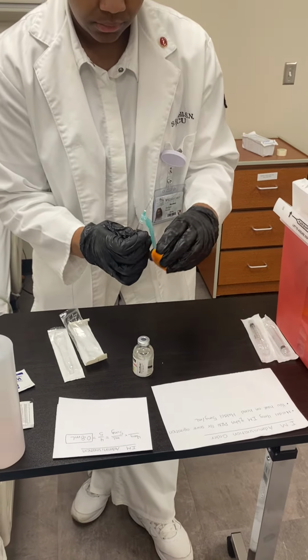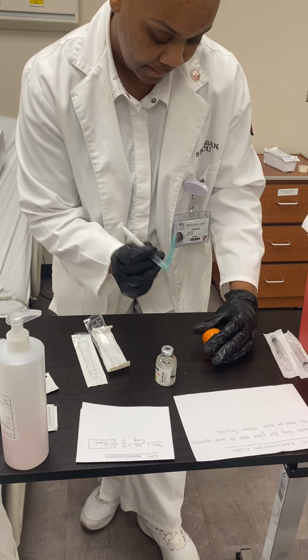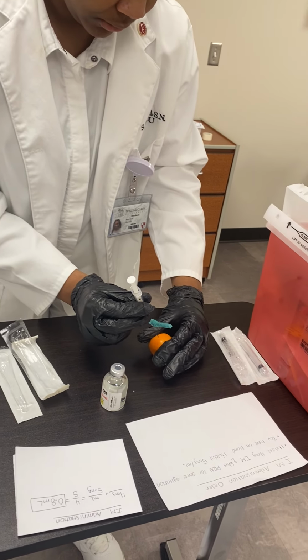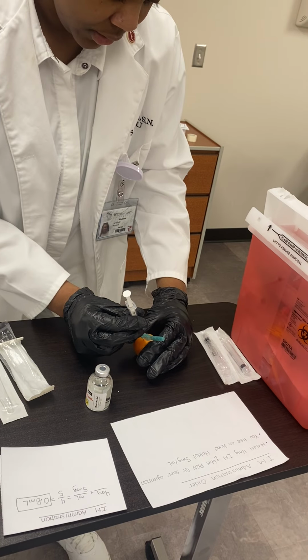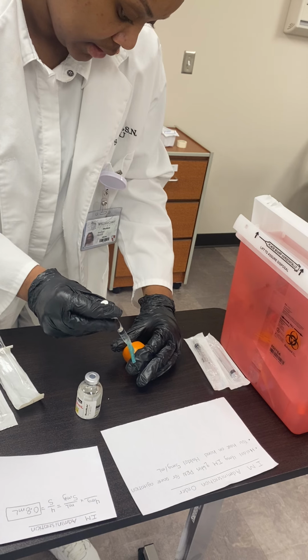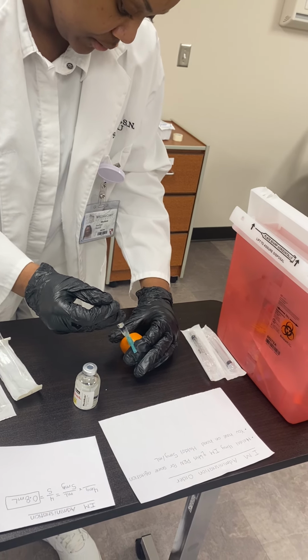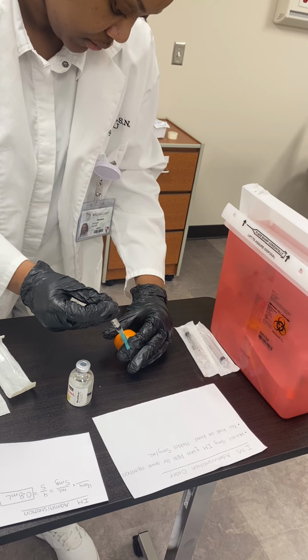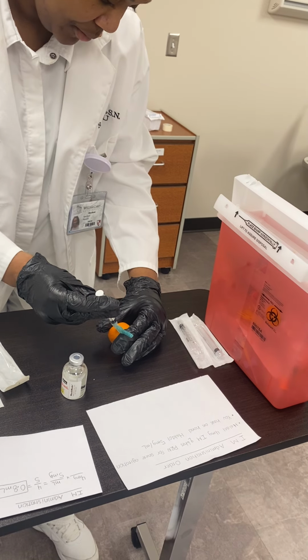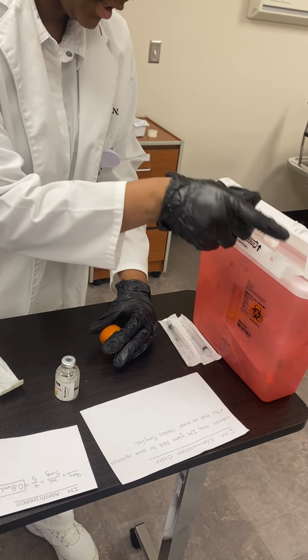With my needle, just kind of pull the skin tightly back. I'm gonna insert at a 90-degree angle. Insert. And I'm going to aspirate. And I'm going to go ahead and slowly inject this medication. And just leave it there for a second. Remove the needle. I would place in the sharps container.